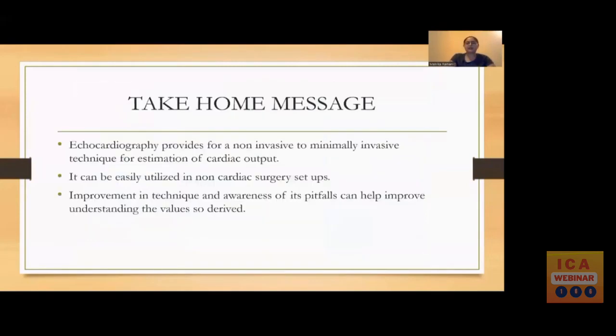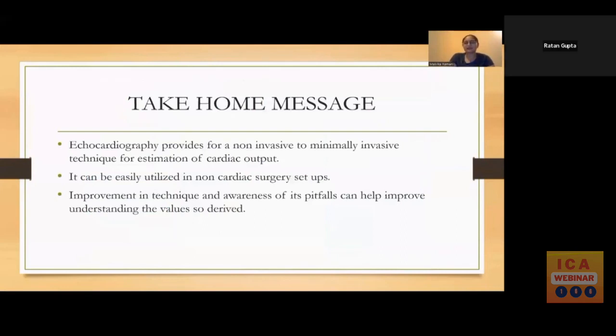So the take-home message that I found is that echocardiography is a non-invasive to a minimally invasive technique that we can utilize for the estimation of cardiac output. You can easily utilize it even in non-cardiac surgical setups. And in fact, even the monoplanar probe, they have recently published a study in 2022, which states that they were able to immediately assess a patient's requirement in the post-cardiac surgical care unit, and in fact, even preemptively diagnose tamponades, which helped in management of the patients.